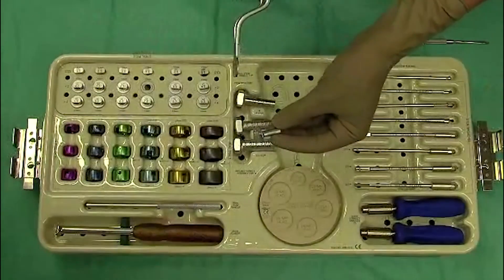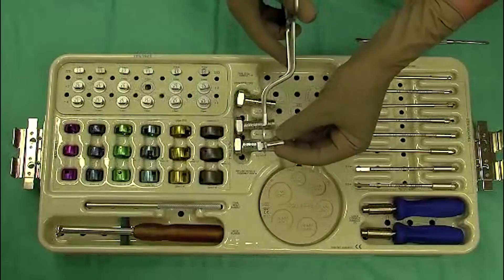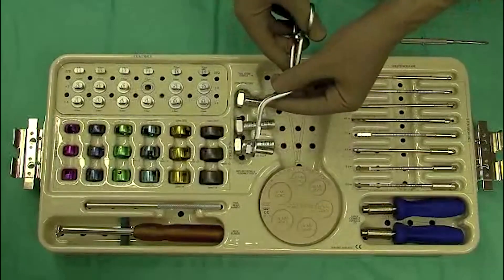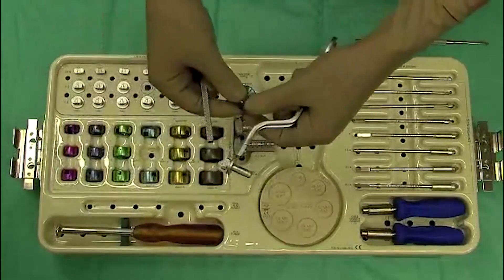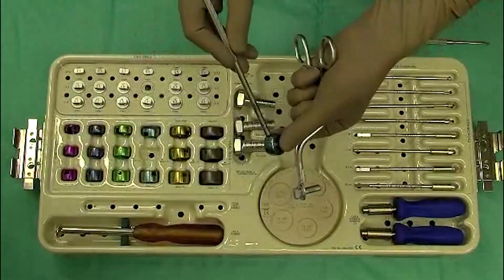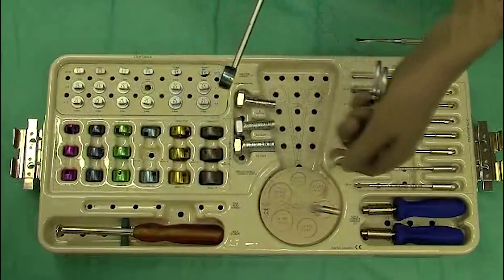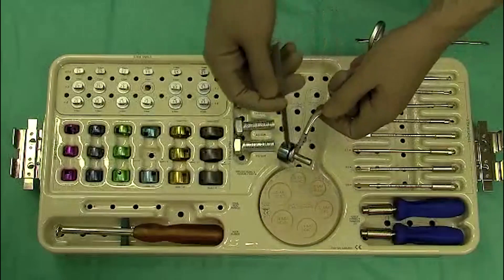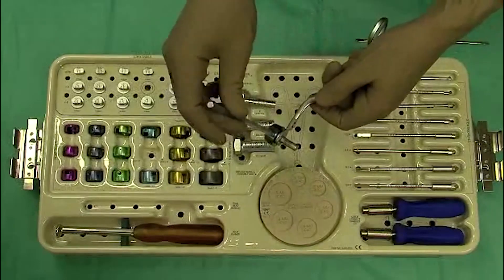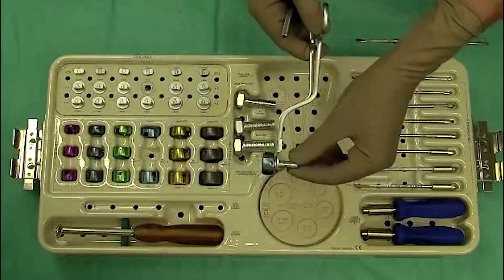In order to insert the trial implants, we have a stem holder which securely grasps the stem, and we have a head holder for the trials. These simply screw into the heads, and then the stem is put into the patient. The head slides over, and then by turning them 90 degrees, there are some ball plungers which hold the implants together during the trial reduction.